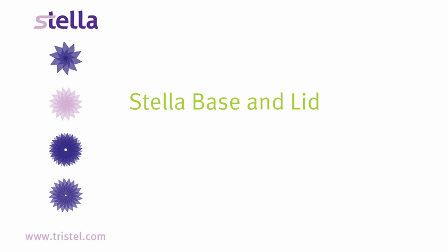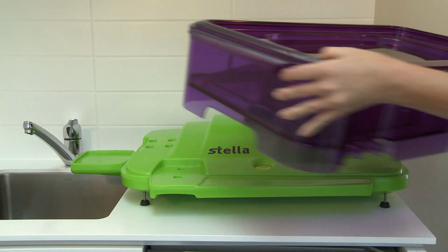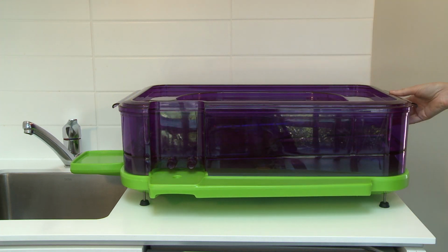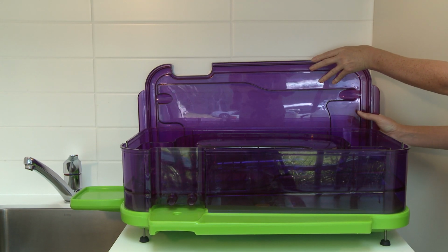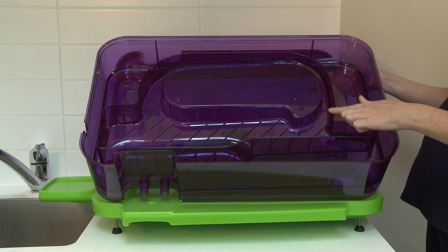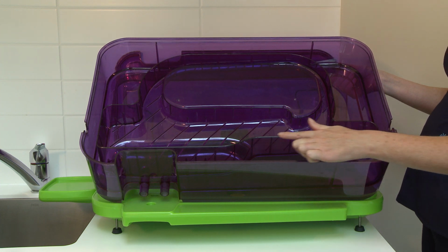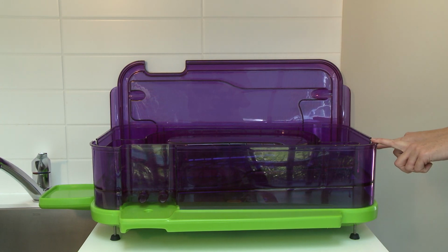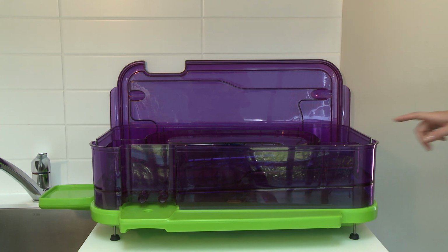Stella Base and Lid. Stella Base is the disinfectant chamber that holds medical instruments. Stella Base is placed on the cradle. The base has an inner chamber where the instrument is placed for disinfecting. The outer chamber is for the disinfectant overflow. A cutout on each side of the base allows for instrument's parts that cannot be disinfected to exit, keeping clear of fluid. Check with the instrument manufacturer to confirm which parts must be kept dry.